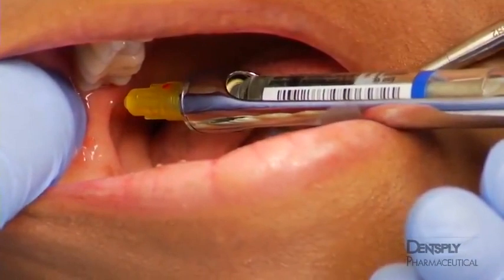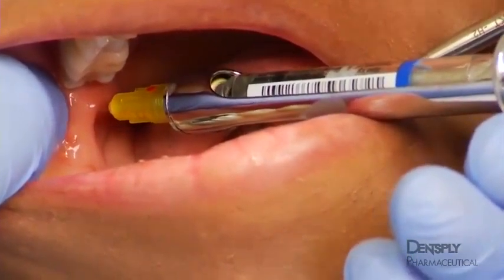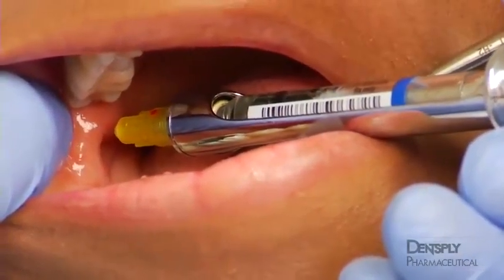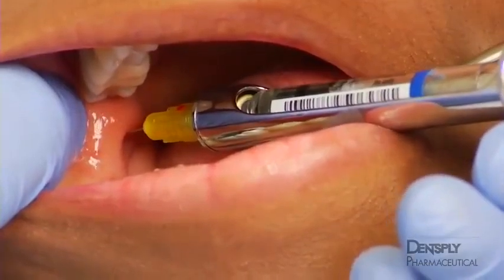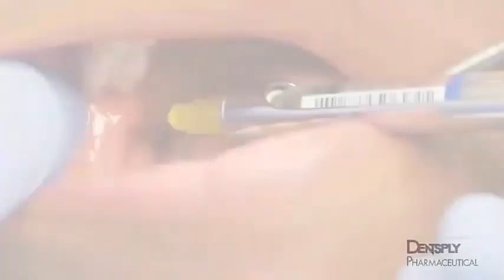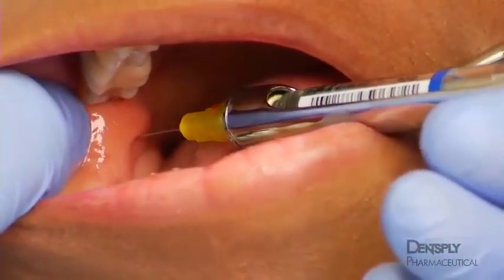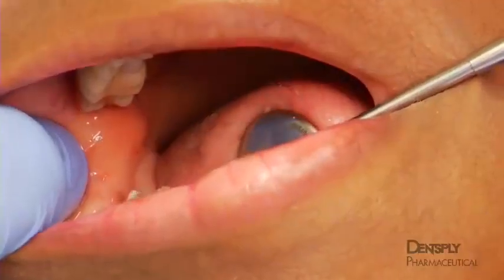After a negative aspiration, approximately 2/3 of the cartridge is injected at a rate not to exceed 1 cartridge per minute. If lingual nerve anesthesia is desired, it can be easily achieved by withdrawing the needle halfway and depositing the remaining third of the cartridge after a second negative aspiration test. The needle is then removed and the patient is allowed to rest for the 3 to 5 minutes it normally takes for anesthesia to develop.